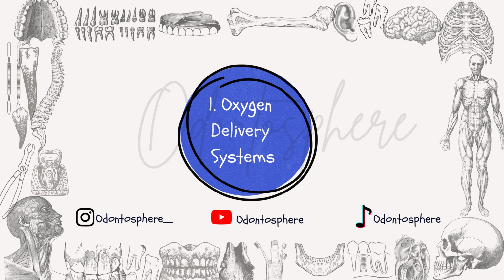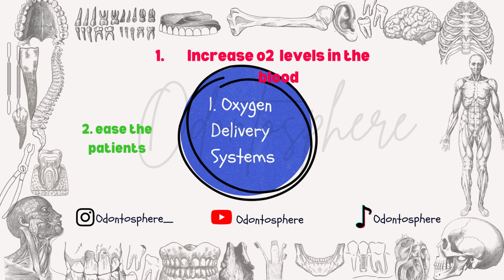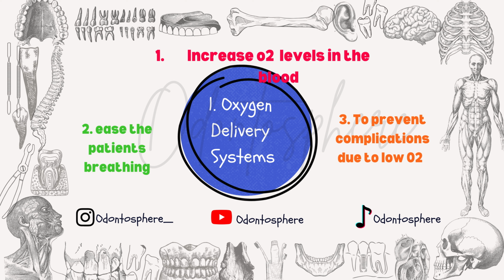Okay. Oxygen delivery systems refers to the medical equipment and methods that we use to provide oxygen to a patient who needs help breathing or to maintain proper oxygen levels in their body. The reason we give oxygen in medical crisis includes some of the following reasons. One, to increase the oxygen levels in the body. Two, to help ease the patient's breathing. And three, to prevent complications that can arise from oxygen deficiency.